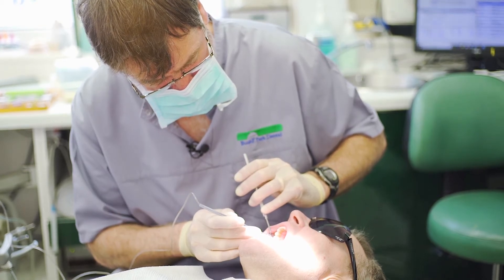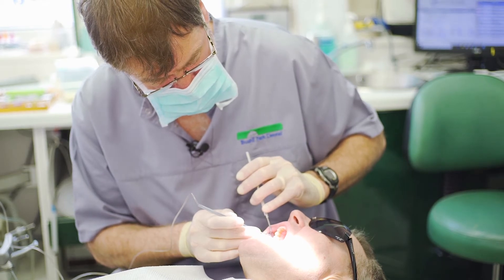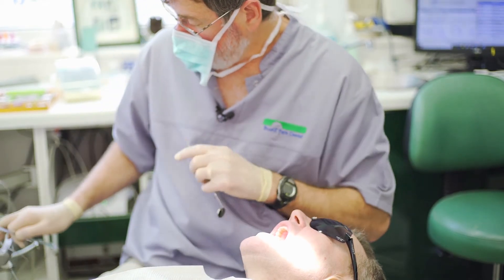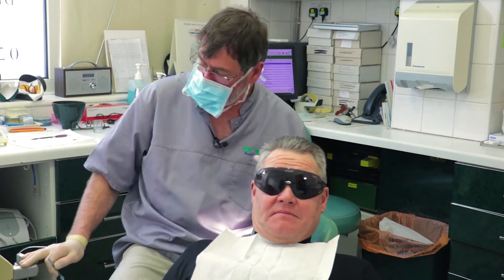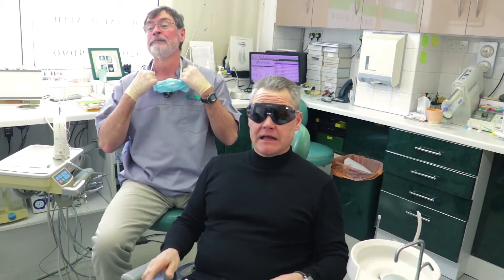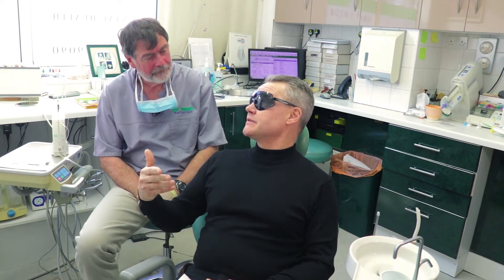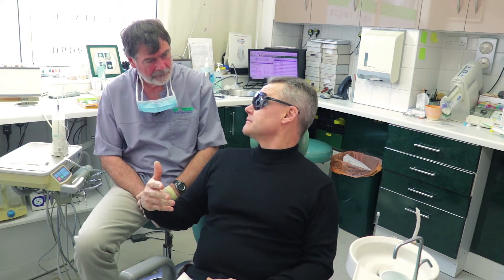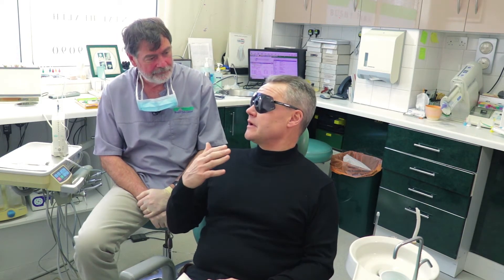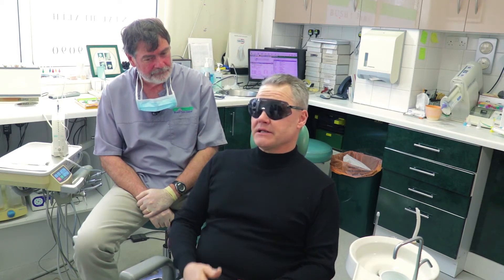So we'll have everything done as well as we need to, and we can now get on and do the dentistry. There you go — that's your first experience with the magic wand. If you'd like to have a little rinse out, you may do so. It was absolutely pain-free. Even when you said I might feel a little scratch, there was nothing, nothing at all. And I don't think I've ever had a palatal injection before, and it was completely painless.